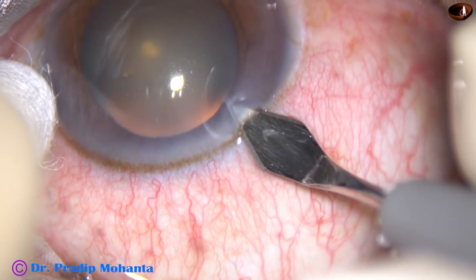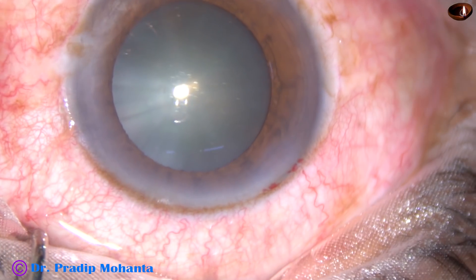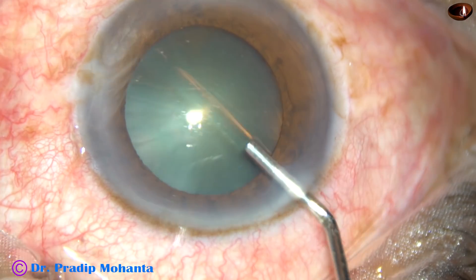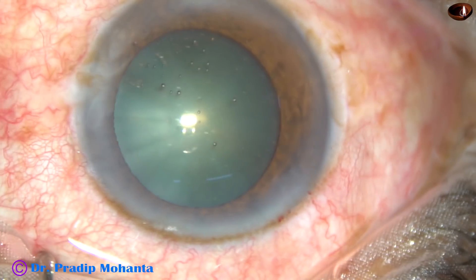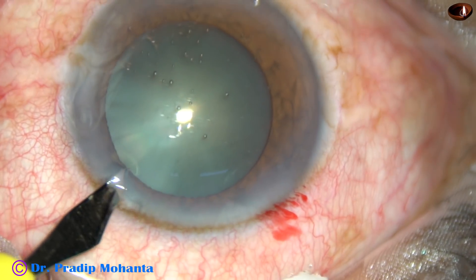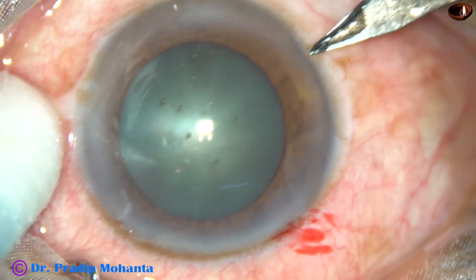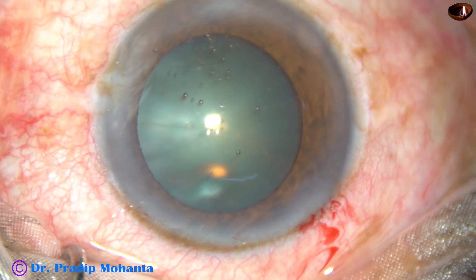This is the main incision on the posterior aspect of the limbus. You can see oozing of blood from the lips of the main incision. This is 2% HPMC filling the anterior chamber. Now two side ports are being made — one on the left side of the main incision, about 2.5 clock hours away, and another on the right side, about 3 clock hours away.